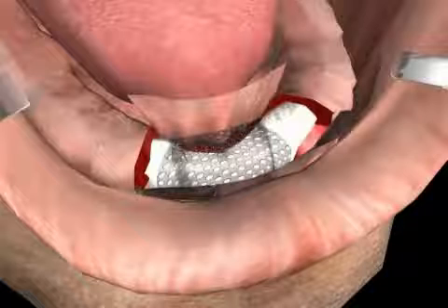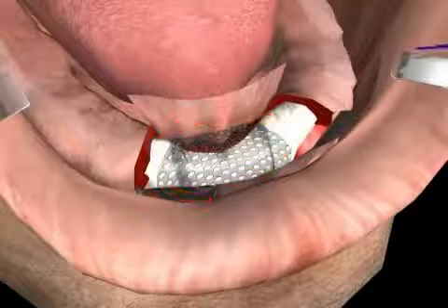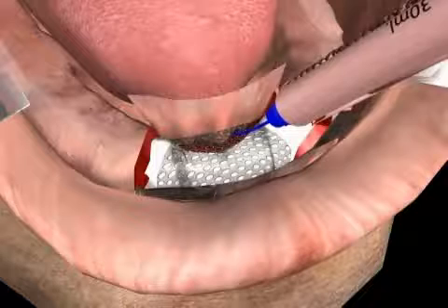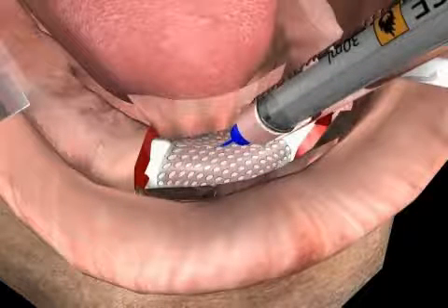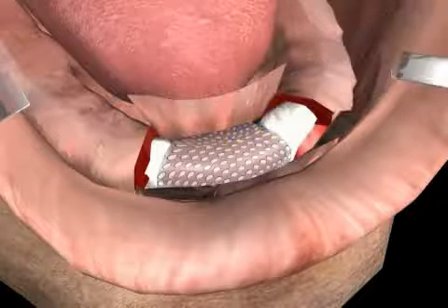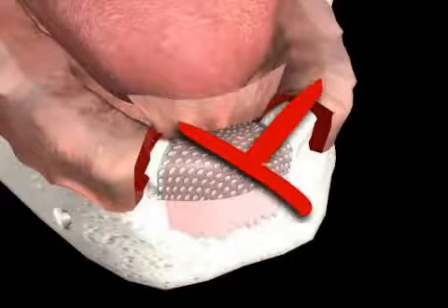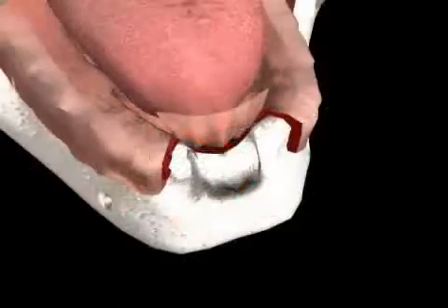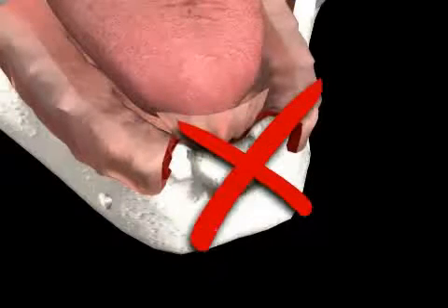Then the mold is inserted. The mold fits the defect precisely because the stereolithographic model was obtained from the patient's CT data. Now the bone substitute material is inserted below the foil, and the mold prevents the bone substitute material from shifting. Because of these placeholders, you don't have to use your own bone blocks.